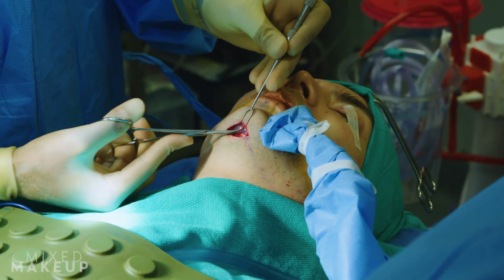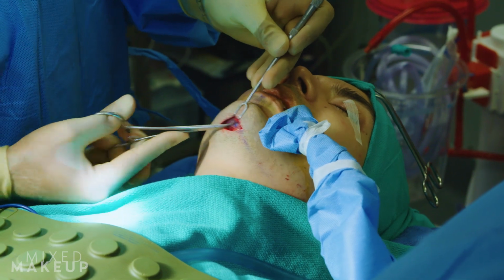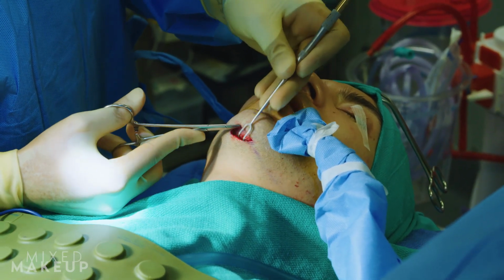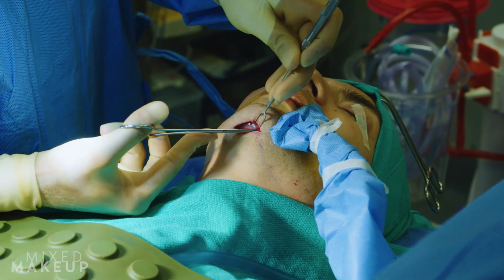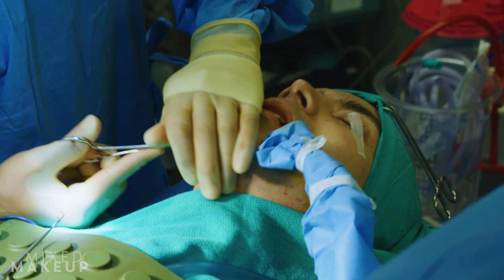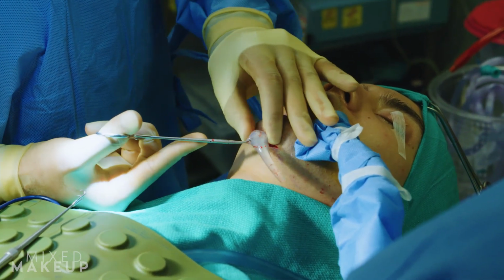So as you see right here, here's the implant, and I've loosened it so that it's ready to come out. And once it comes out, it actually helps me with some of my dissection because we have had an implant in place. Okay, and you can see here and here.